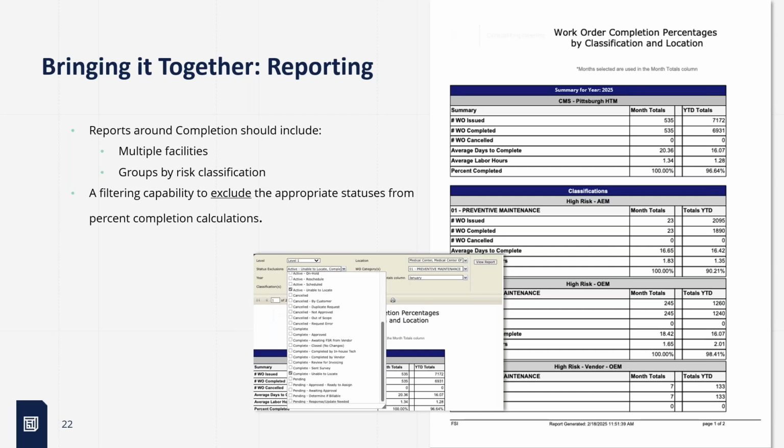That needs to be as push button as possible because the teams are busy out there, with the added flexibility of including those UTL rates so that you can report against that to, say, the EOC committee when you're wanting to illustrate the fact that, yeah, we're doing a great job, but team, we could use your help in finding these devices.